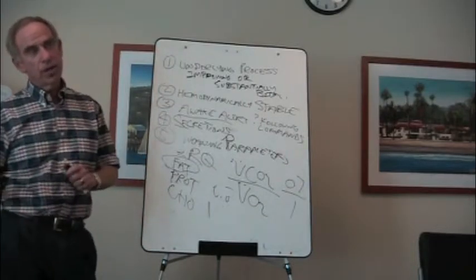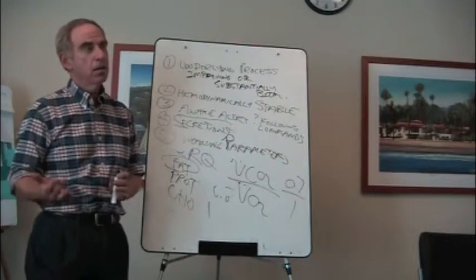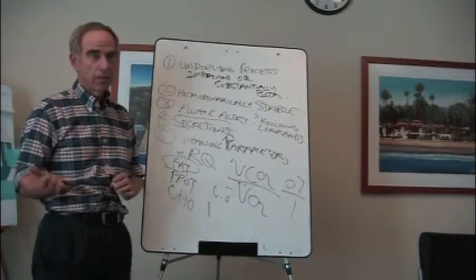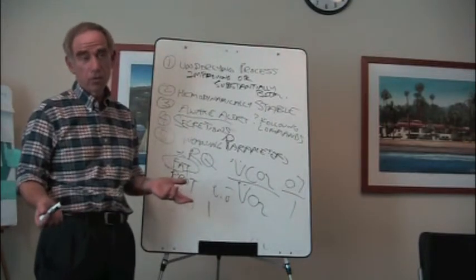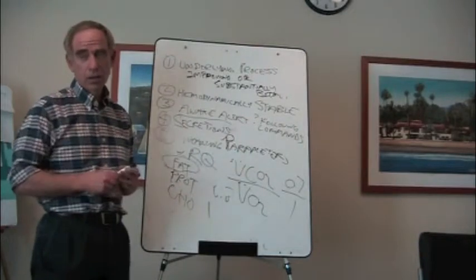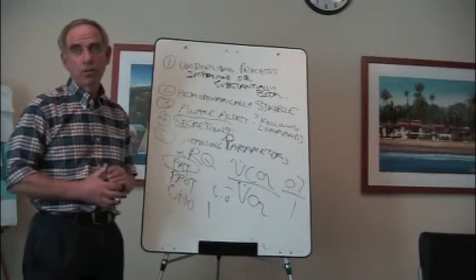You can actually measure oxygen consumption using a metabolic cart. And some places do that. It's difficult to do on ventilators in clinical settings, so most places don't do that. And we don't do it here. We did it for a while years ago, and it never seemed to work, and everybody sort of ignored the results, so we stopped doing it.